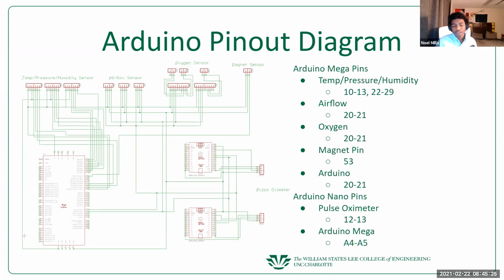One problem we ran into was that the patient side Arduino is a slave to the nurse's station Arduino, which had a problem with our pulse oximeter, which also uses the I2C ports. But you're able to use some of the SPI ports instead of I2C with some minor issues, and that's what we use instead for the pulse oximeter.